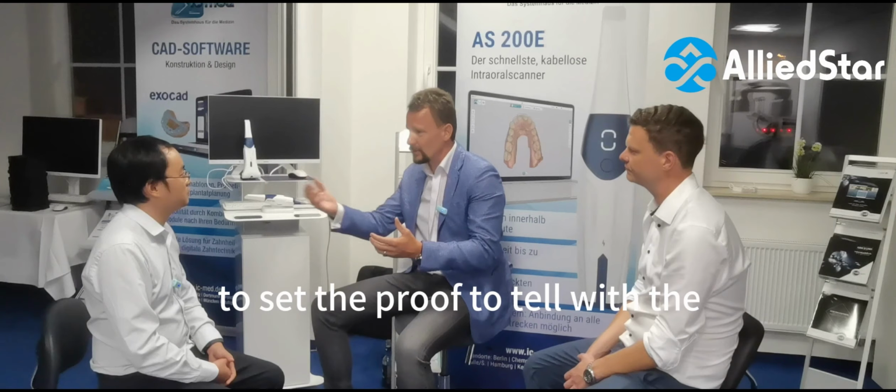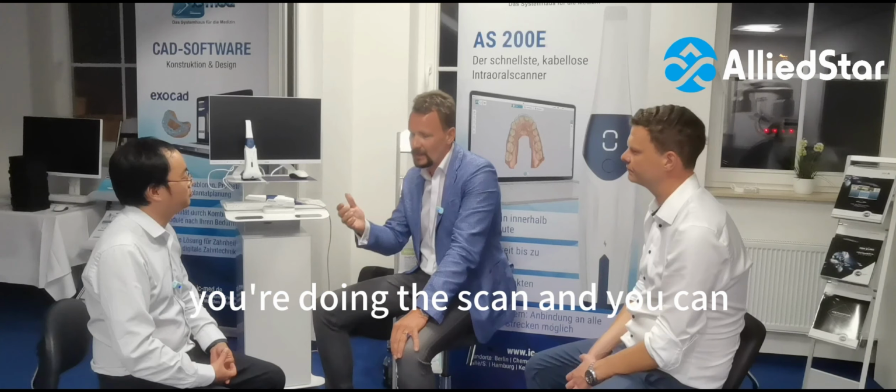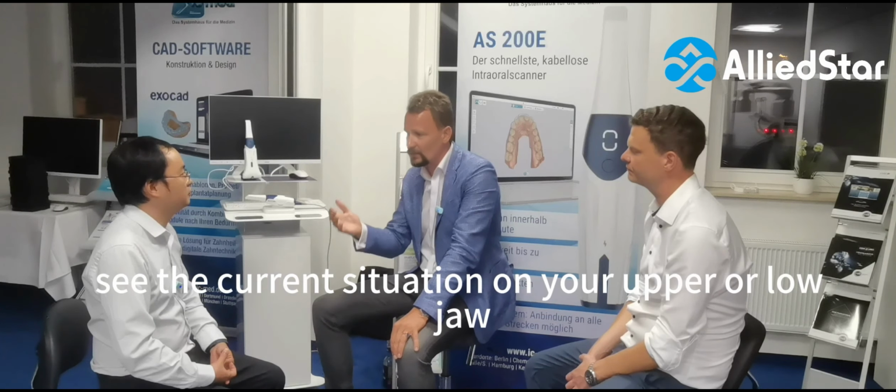There's a need to show proof, to tell the patient with an open communication tool what they are doing. That's a very positive side effect of the scanners, that you can show the patient before and after. When the patient enters the clinic, you do a scan and you can see the current situation on the upper or lower jaw without any issues.